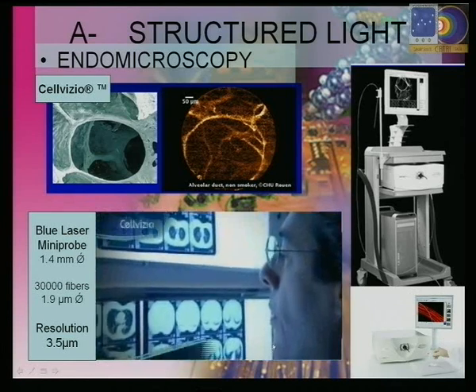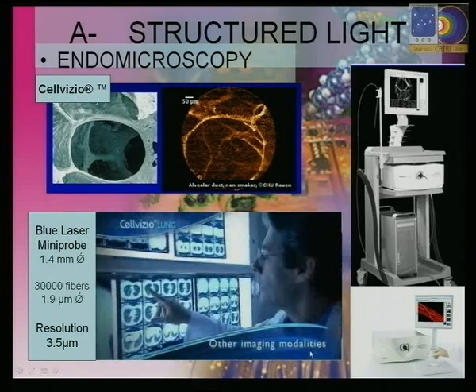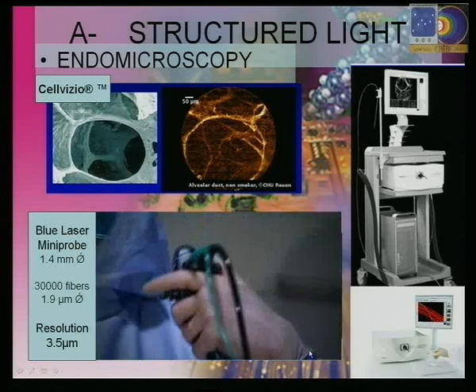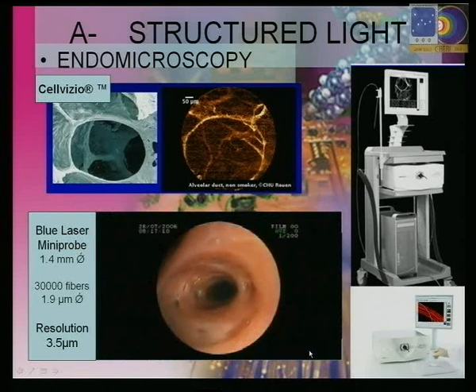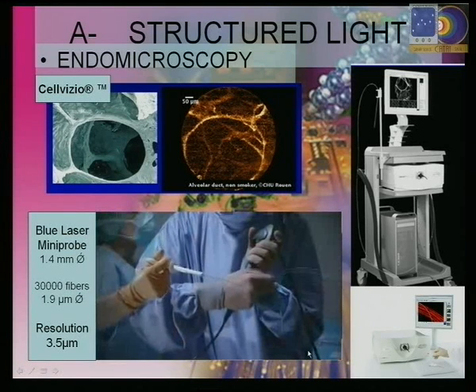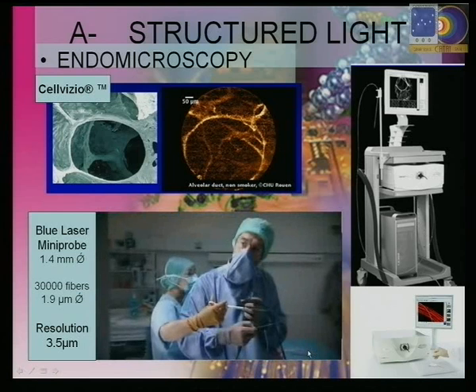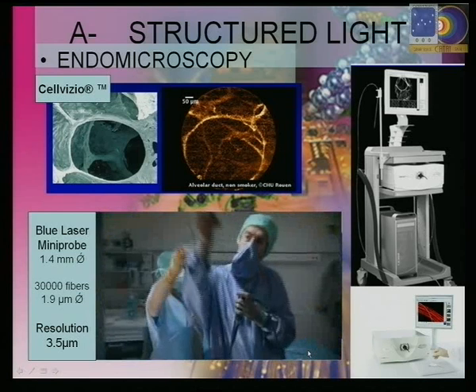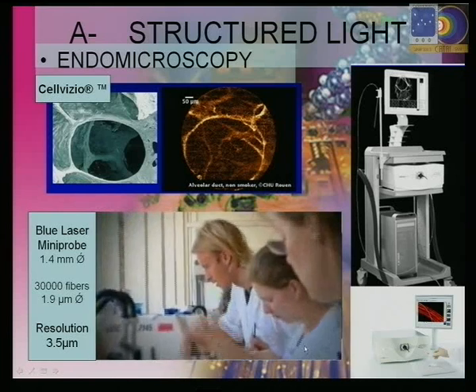Of the imaging modalities currently available, none can produce live microscopic images of the alveoli in real time. Standard bronchoscopes cannot reach the distal lung, and obtaining biopsies can be risky. Even when samples are safely taken from the patient's body, histology cannot provide functional or dynamic information.